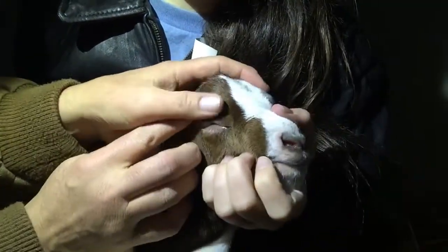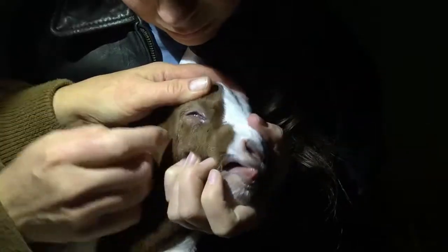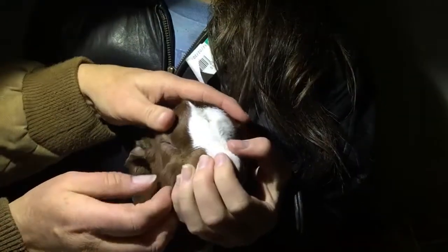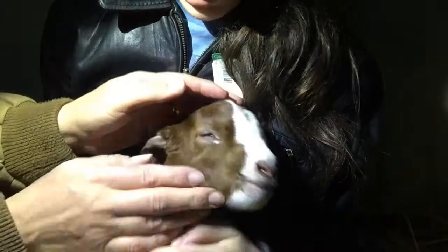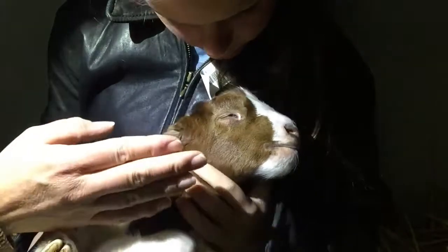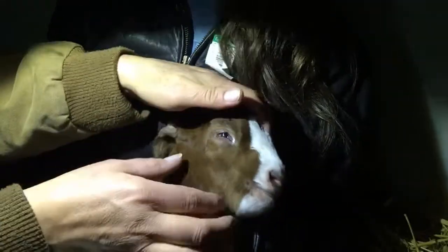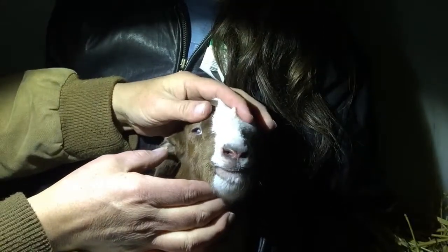If you look here, that seemed awful, but right now you can see his eyelid is flat against his eye. Right there. Oh, he's loud, especially since we're inside this little dome. But that actually is less painful for him right now. That procedure obviously wasn't very pleasant, but it's easier for him now because it's not scratching on the surface of his eyeball anymore.